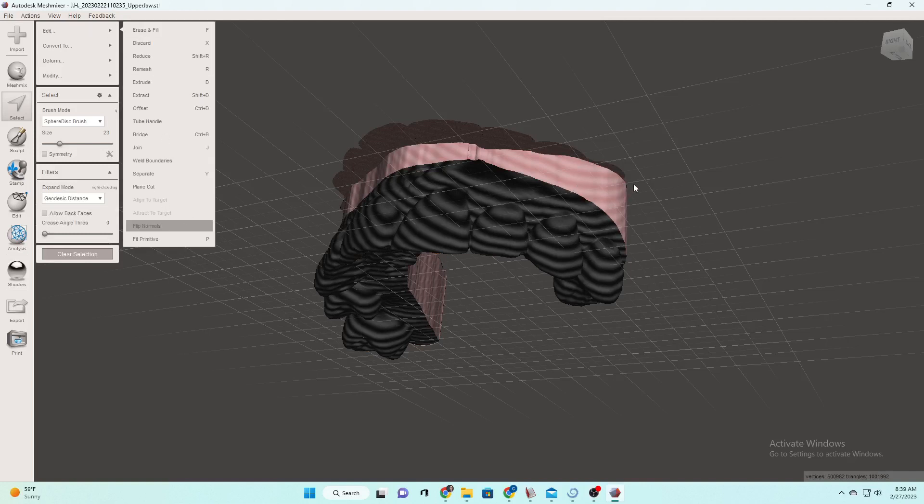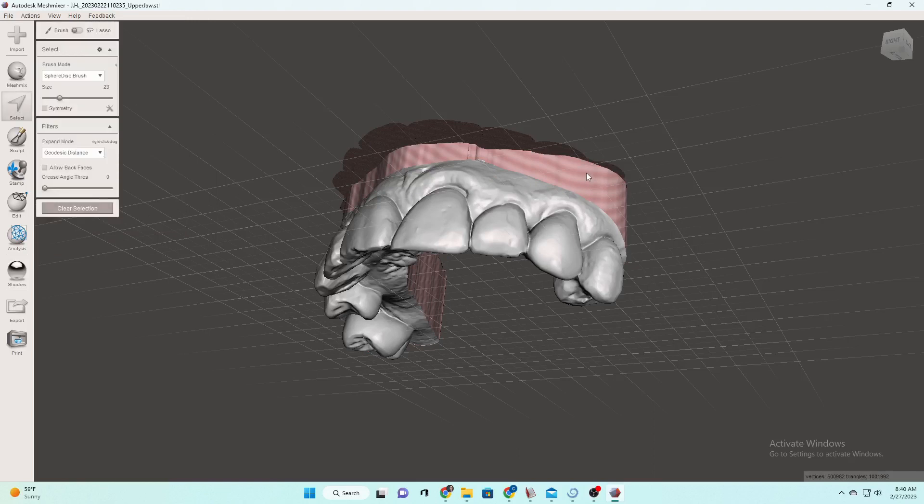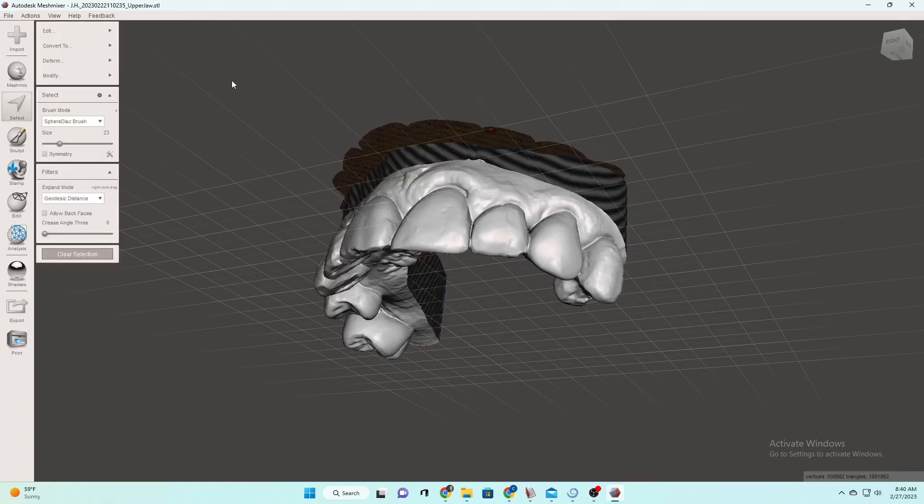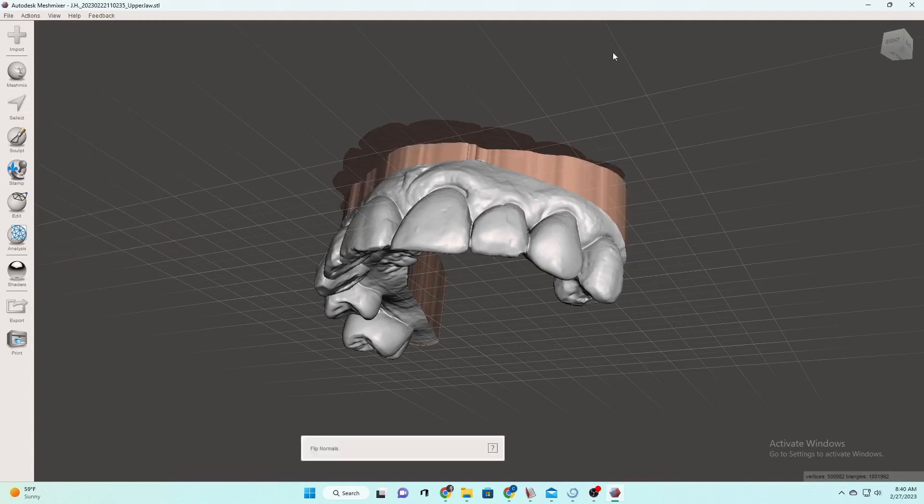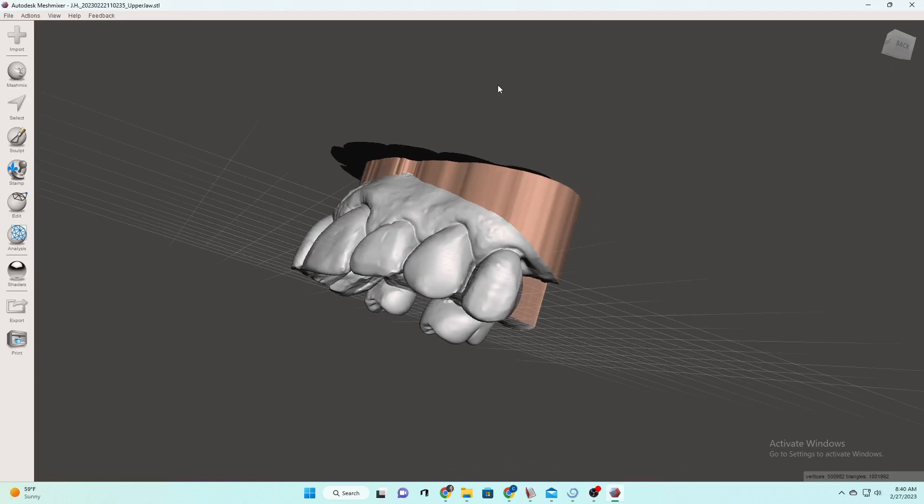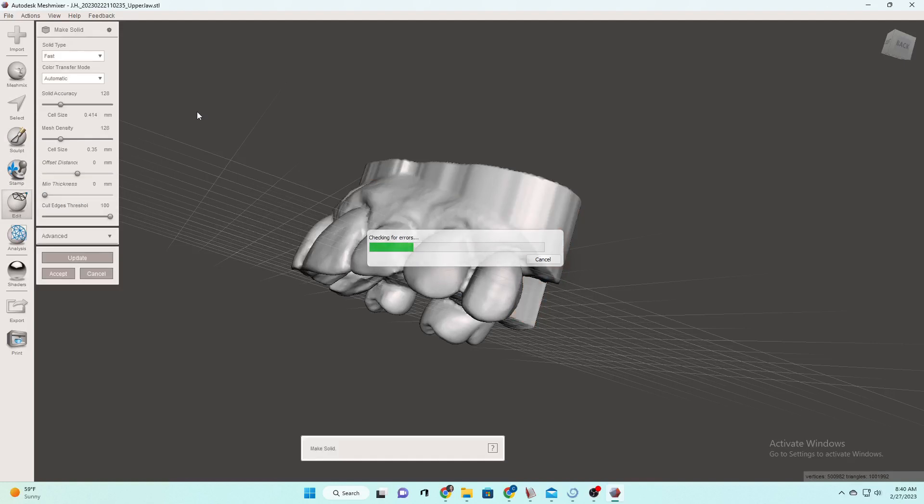Then we will go to accept it, but then we're going to go while it's highlighted and flip the normals because on the upper, because this computer program is not built for dental, it doesn't automatically know what surfaces. Sometimes it flips them inside out. So if you see them striped like that, that means it is inside out. So just highlight it and flip normals.